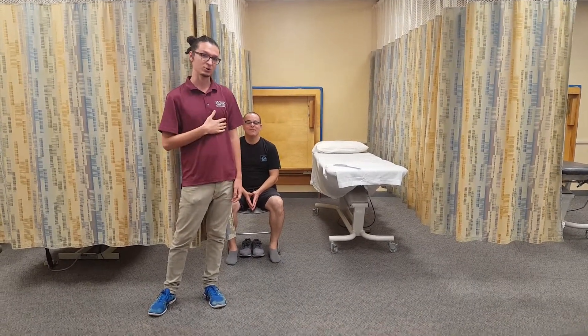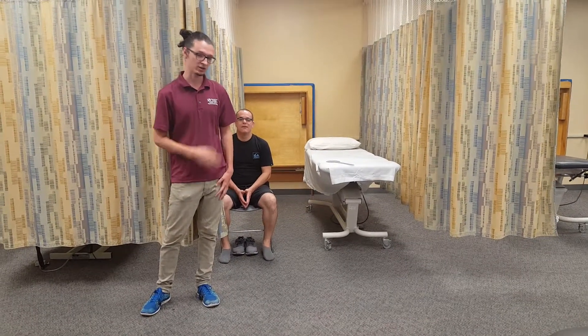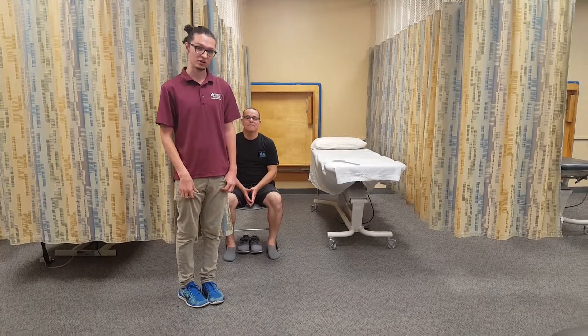Good afternoon. My name is Joshua Lane. I'm a student physical therapy assistant here at Miami Dade College. Today I'm going to be measuring hip abduction range of motion, and according to the AMA the normal range for that is 40 degrees.